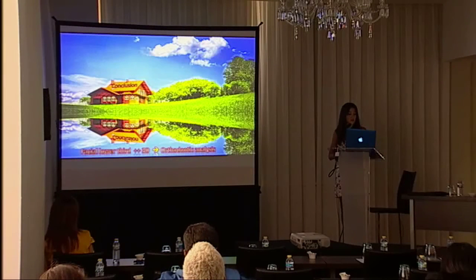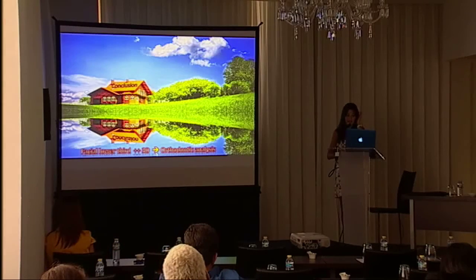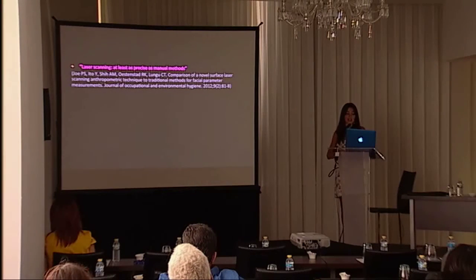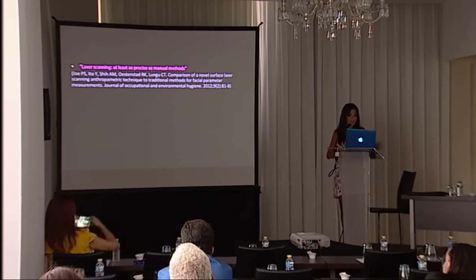So in conclusion, and based on our results, the facial lower third was mainly better seen in 3D, which is good for orthodontic analysis. The laser scanning has been shown to be at least as precise as the manual methods, so measuring directly the distances on the patient's face.